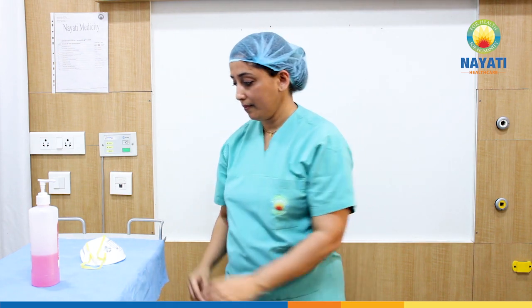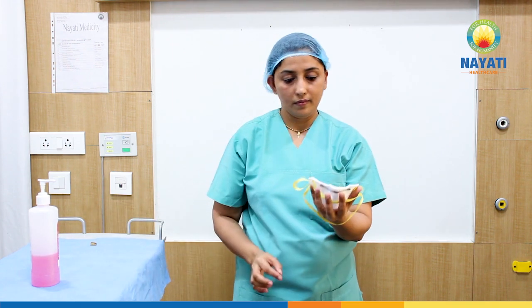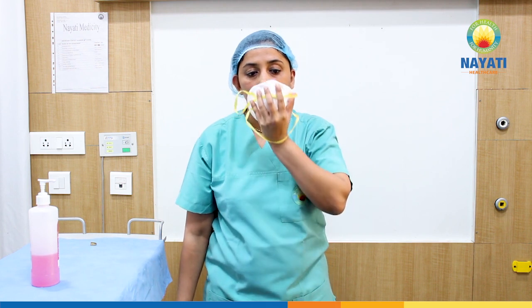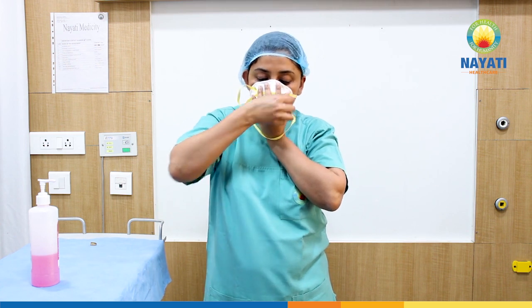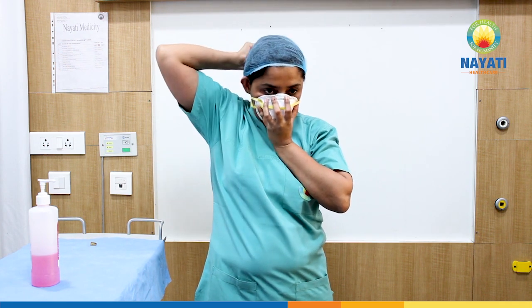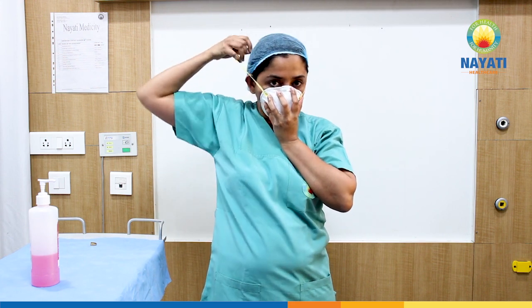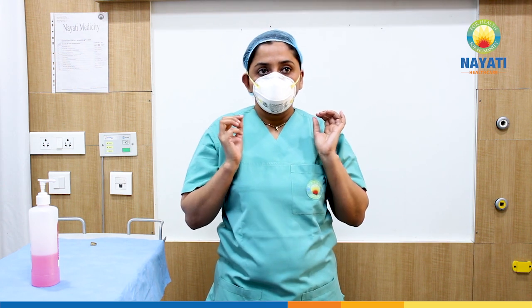Select an N95 mask that fits you well. Hold the mask in your dominant hand, touching the outer surface only. Place it firmly over your nose, mouth, and chin. Stretch and position the bottom band under your ears. Then stretch the upper band high at the back of your head. Press the nose clip along the upper edge gently against the nose bridge and press laterally to fit.